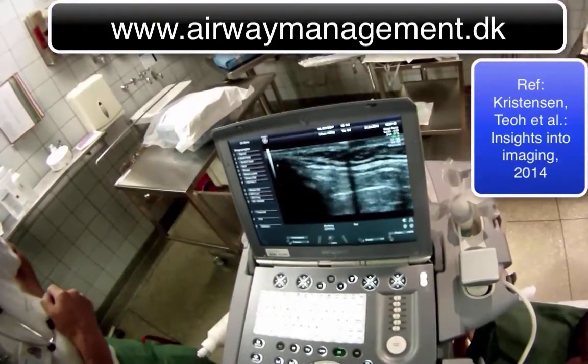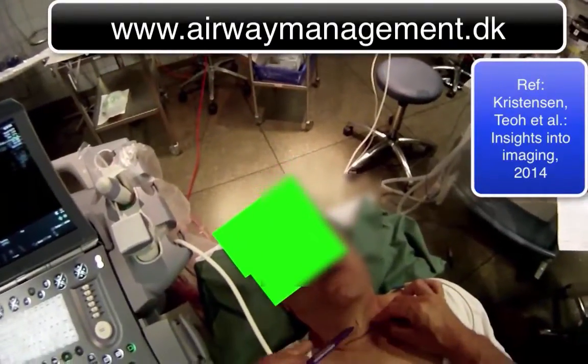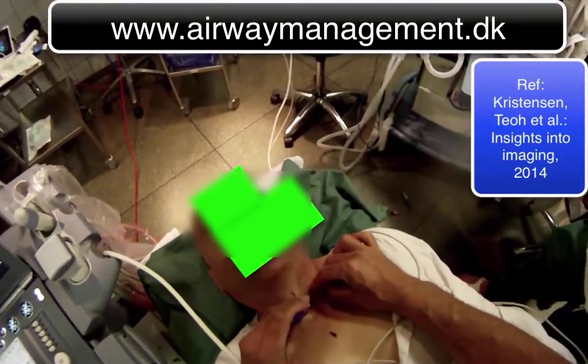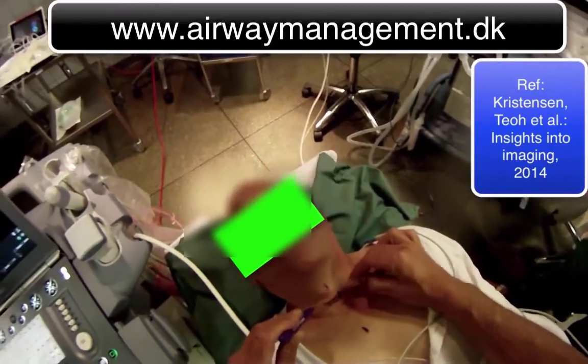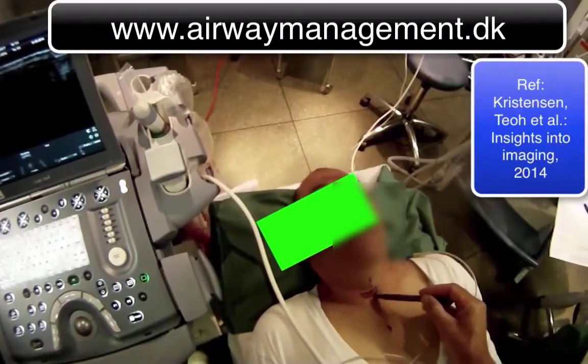There it comes. I can mark the cricothyroid membrane with a pin — and there I got it.